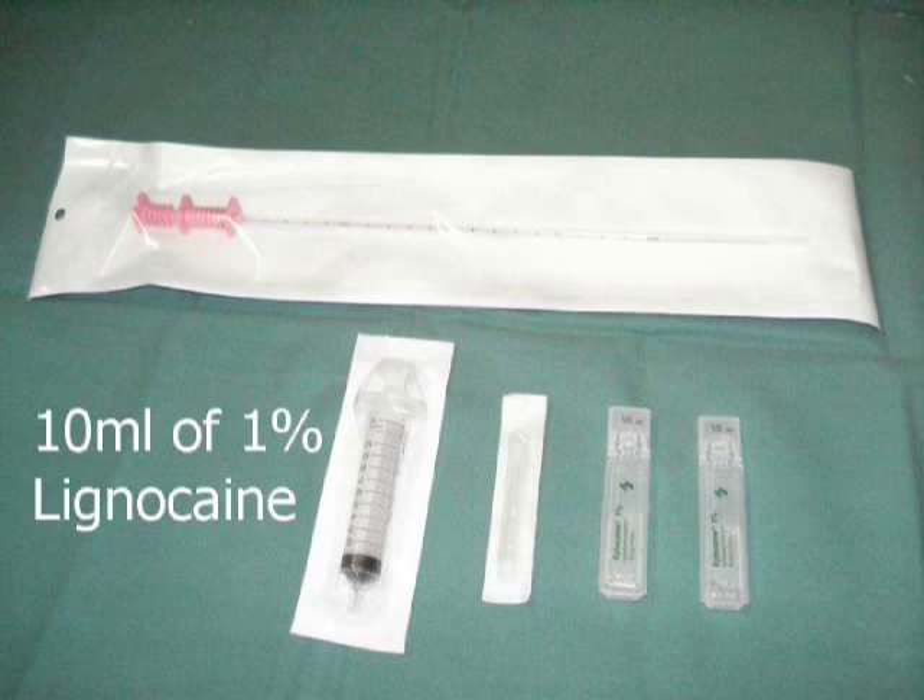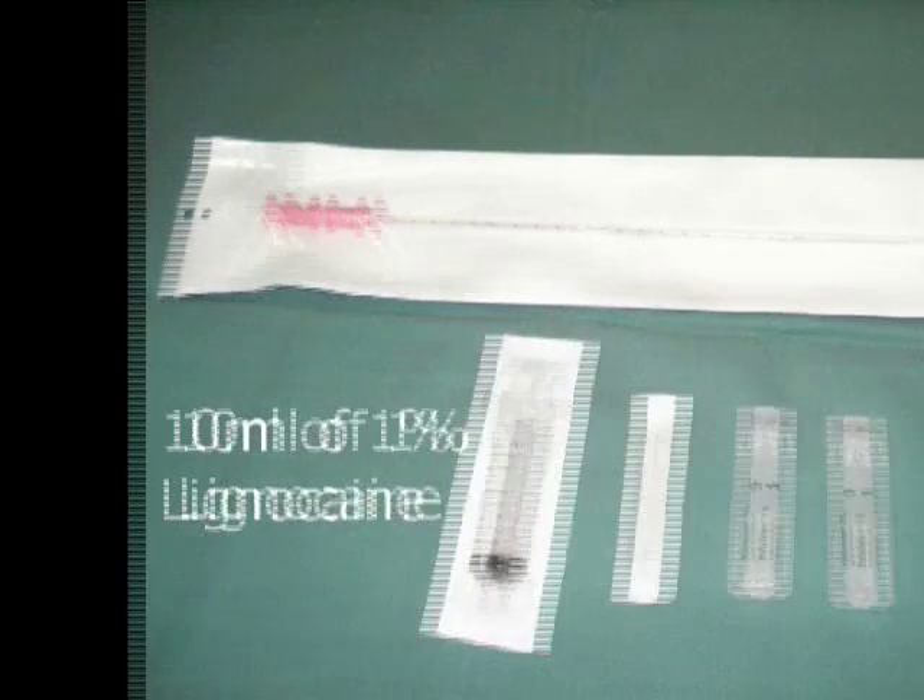10 ml of 1% lignocaine is our choice for periprostatic nerve block.